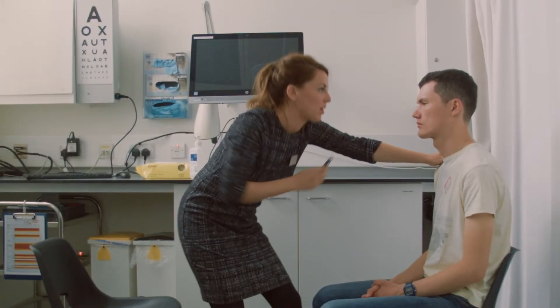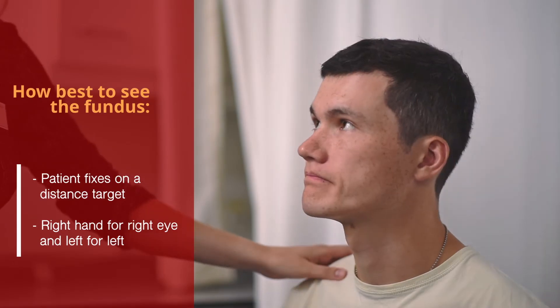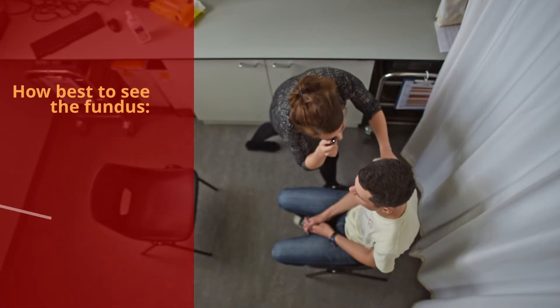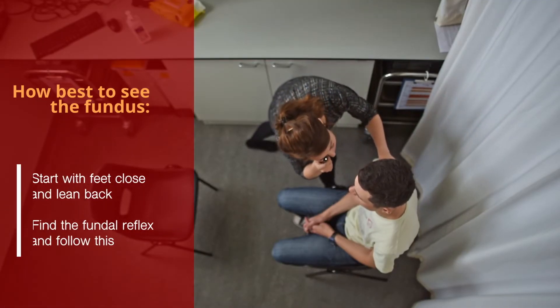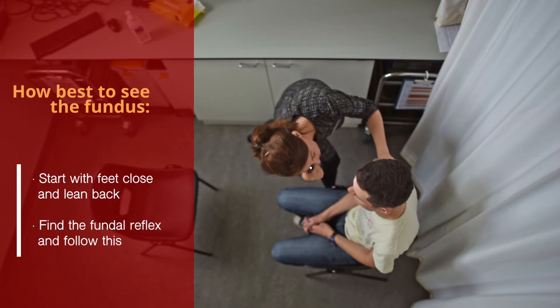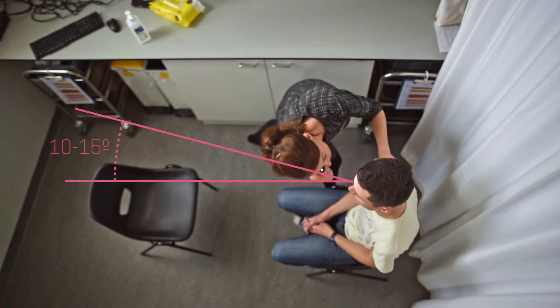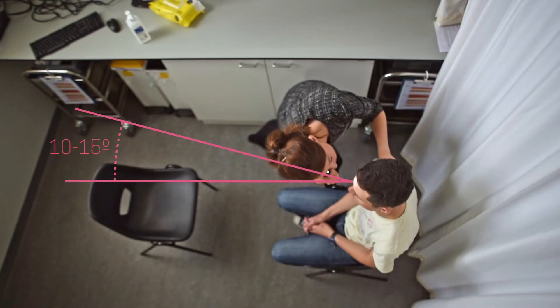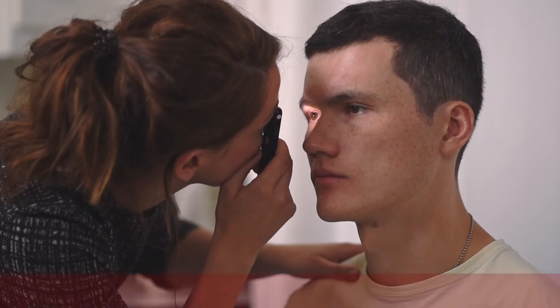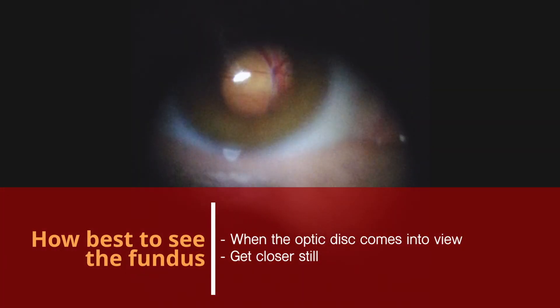Next, examine the back of the eye. Ask the patient to fix on a target in the distance. Use your right hand and right eye to examine their right eye and your left for their left. Start with your feet close to the patient and lean back. Identify the fundal reflex and follow this, moving in on a path 10-15 degrees temporal on the horizontal. When you're close to the eye, the optic disc should come into view. Go in closer still and you'll get a wider and more stable view.